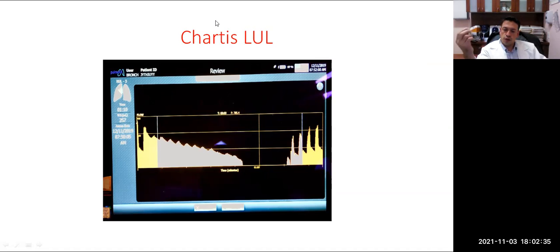And you're not sure, is it really because the fissure looks good, or is it because you have this distal atelectasis settling in, especially in the lower lobes by the diaphragm? It's a little bit confusing sometimes to be comfortable in that area. So lower lobes potentially could be tricky for that reason.